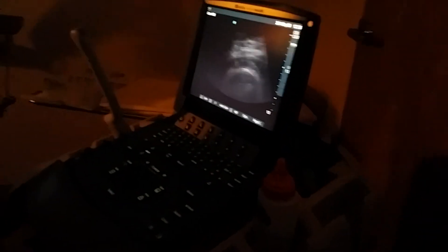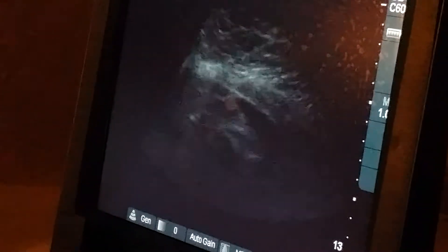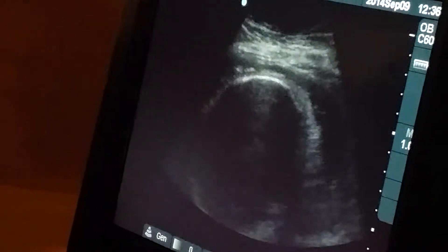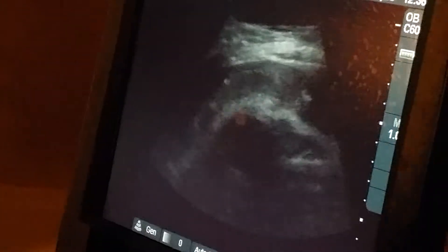Okay, so let me show you the baby's head. Do you see that circle? Let's see if we can get it a little clearer for you. You see this right here? That's the baby's head.